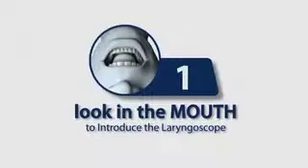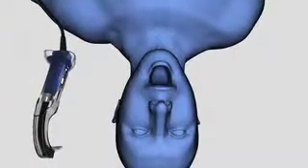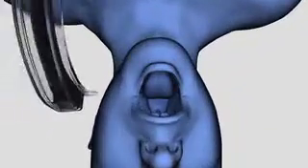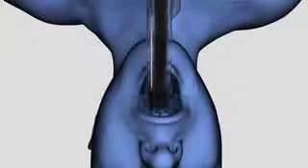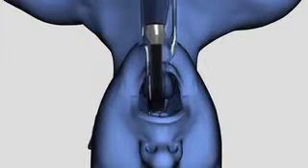Begin step 1 with direct vision, looking directly into the patient's mouth. With the patient appropriately positioned and with the Glidescope videolaryngoscope in your left hand, introduce the Glidescope into the midline of the oral pharynx. Gently advance the Glidescope until the tip of the laryngoscope is past the posterior portion of the tongue.